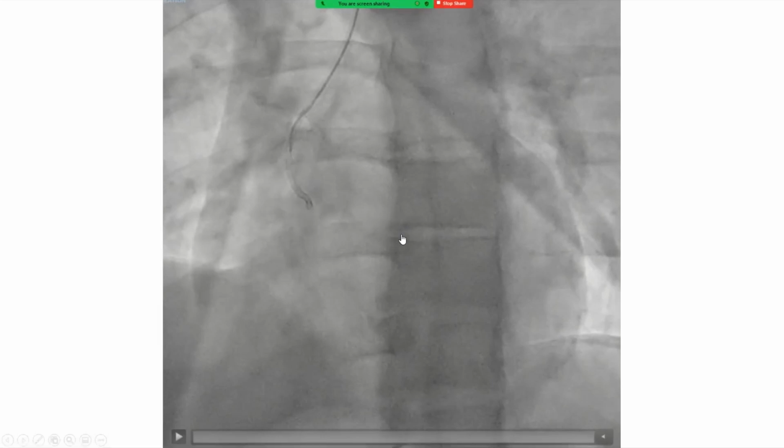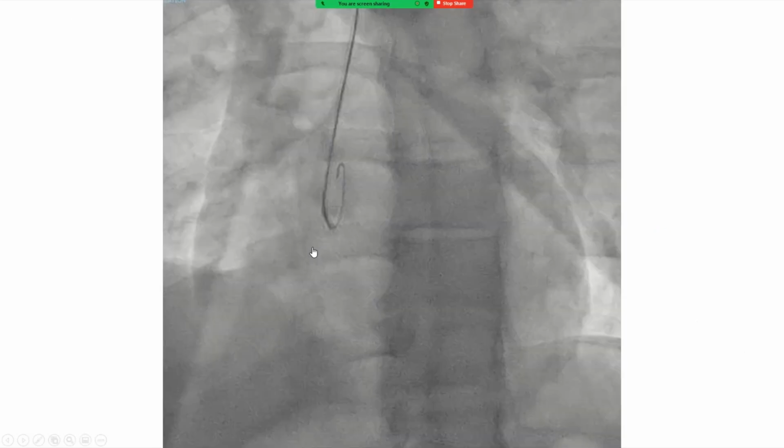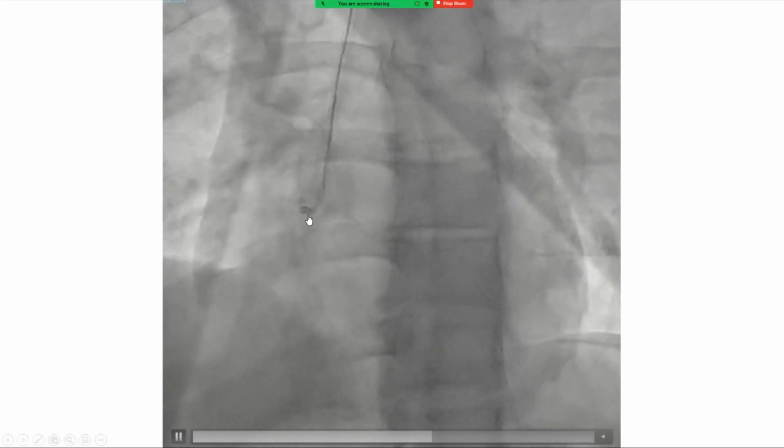duck shape too early. Like I said, the key words: you have to be elongated and free, and you torque, then toward the mid to end, you push. So those are the mistakes he committed here. Again, the tip was stuck, not free, and he pushed too early before he finished his clock.